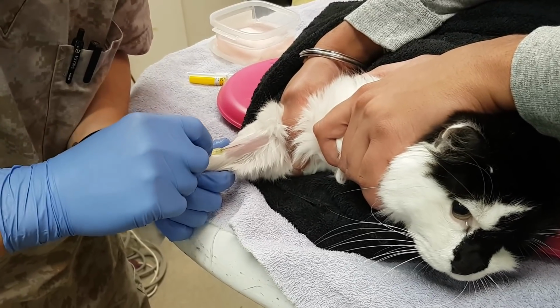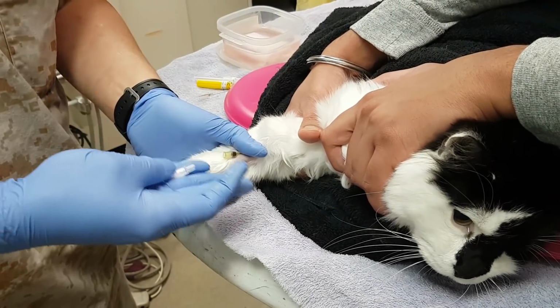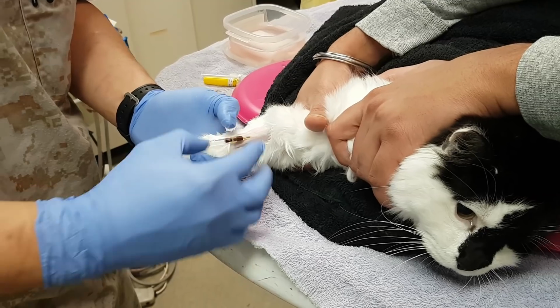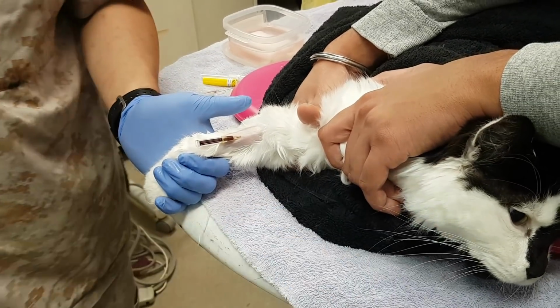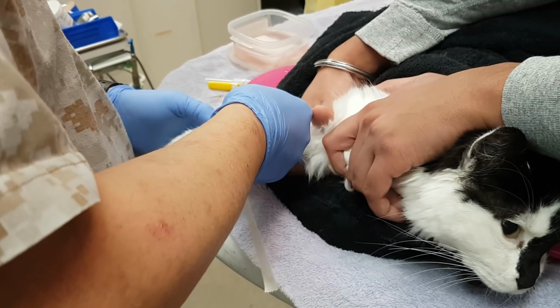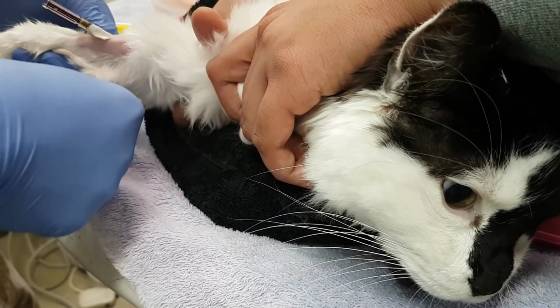Mr. NJ, who is our lead technician, you can see him placing that catheter. He's an absolute master of the art. Placing an intravenous catheter in a cat is very challenging. He makes it look easy. Of course, having the patient properly sedated so that they're nice and calm, but not so that their blood pressure drops, making the veins collapse, is also a bit of an art. And after you get that catheter in, making it stay in place for a couple hours or maybe even a couple days, that is a whole different skill set.